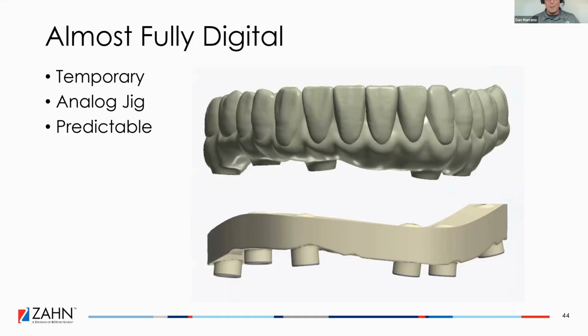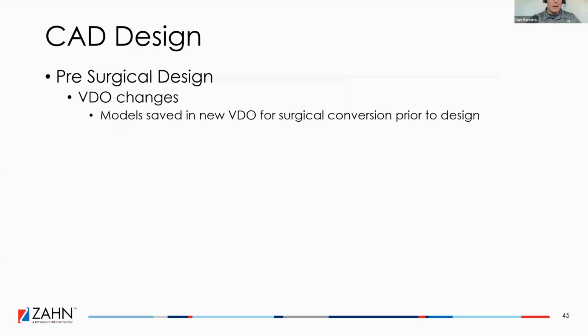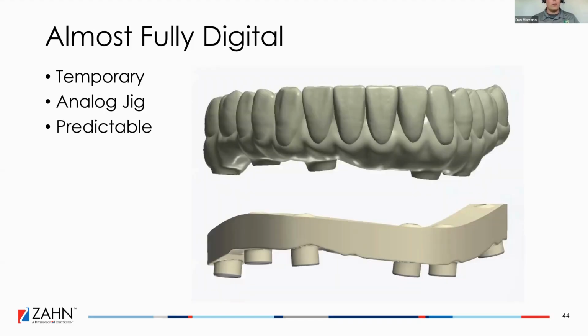I used to cement them in the bar and then cut between each of them. We got too many jigs showing back up in the mail, cracked in half, so that's why we went to the other style. But when he got this case, he had said how nice it was, how accurate it was. He couldn't believe how easy it was to put this in.